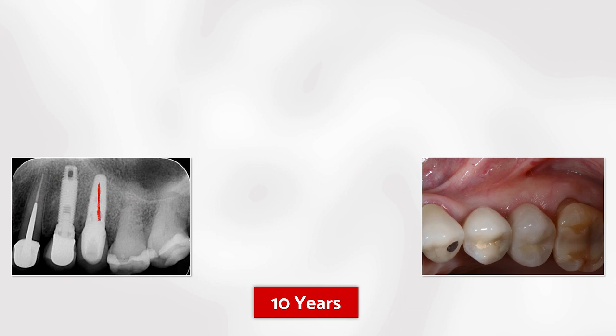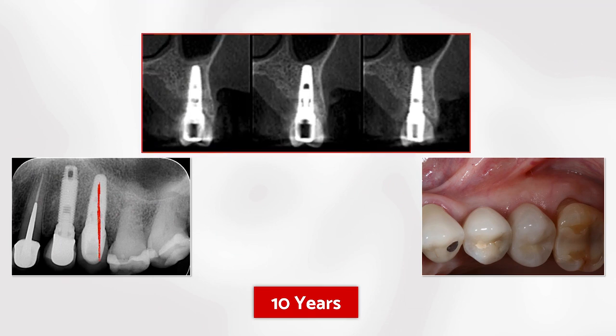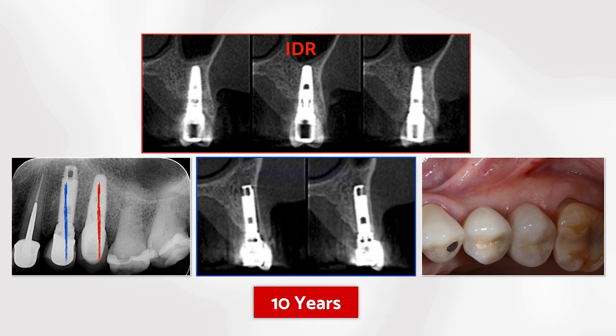10 years post-op, let's carry on following this clinical case. After 10 years, in the second premolar, it was inserted an implant and it was applied an IDR technique. But in the first premolar, a couple of years before we performed the IDR in the second premolar, it was inserted an implant in a healed site.